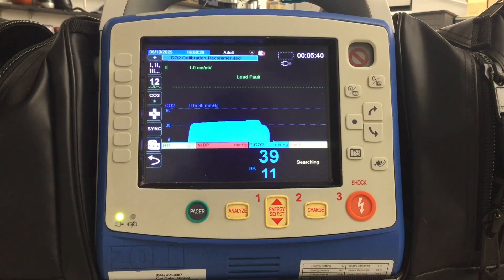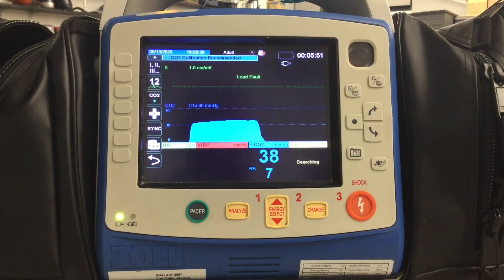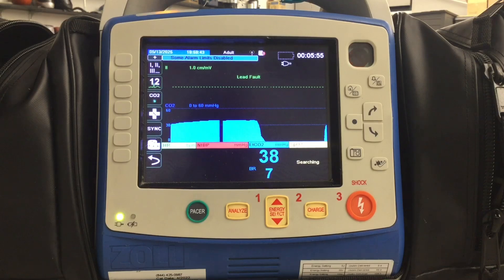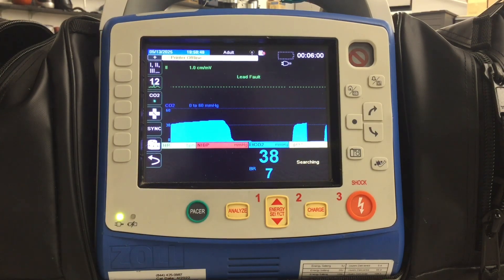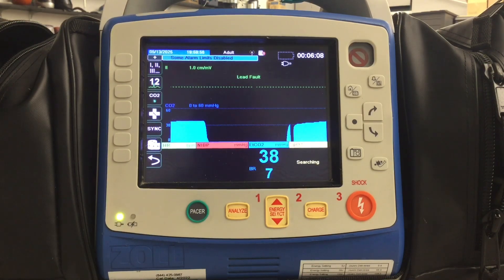When you attach the capnometer to your patient it's going to produce a waveform representing the CO2 levels during the respiratory cycle. There are multiple phases: Phase 1, the baseline — no CO2, flat line. Phase 2 is the upstroke, the beginning of exhalation. Phase 3 is the expiratory plateau, which is steady CO2 levels when exhaling — that's the top of the waveform. Then there's Phase 0, inhalation, when CO2 drops as fresh air enters.